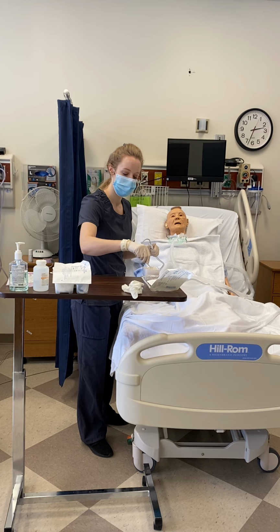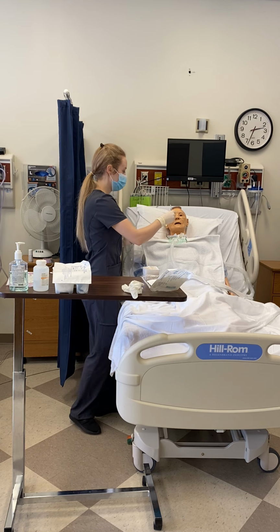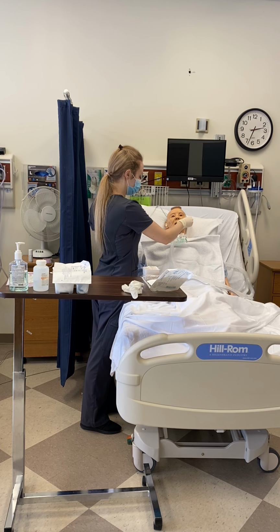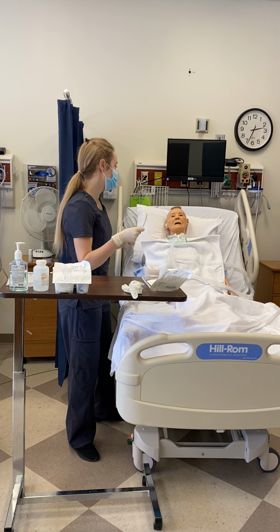Lubricate my catheter. I will have Mr. Smith's neck extended slightly, and I'm choosing to go in the right naris, not applying suctioning as I go in, going down to the depth that I measured, and then pulling back a little bit before I apply suctioning, and then intermittent suctioning, 10 to 15 seconds, pulling back, and then a quick rinse.